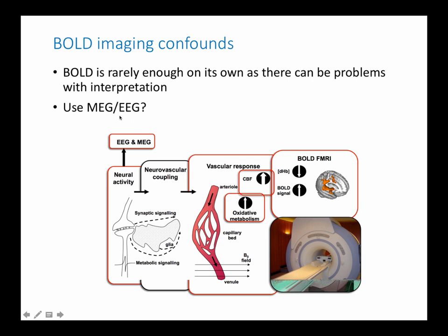So, if you're looking at MEG, you probably can't do MEG and MRI at the same time. They both require large pieces of equipment, and so you're not guaranteed to get the person in the same state on both scans, right? So you basically want to do them simultaneously. So you can do EEG and fMRI simultaneously. So that's what I'm going to be talking about a little bit next.